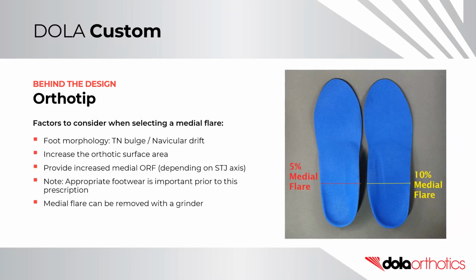Factors to consider and common uses for selecting a medial flare include: to follow significant medial foot morphology, including a talar navicular bulge or navicular drift, to increase the orthotic surface area, to provide increased medial orthotic reaction force depending on the axis location. Note: appropriate footwear is also very important when prescribing a medial flare. A medial flare can be removed with a grinder.